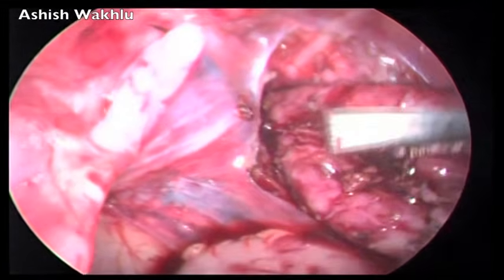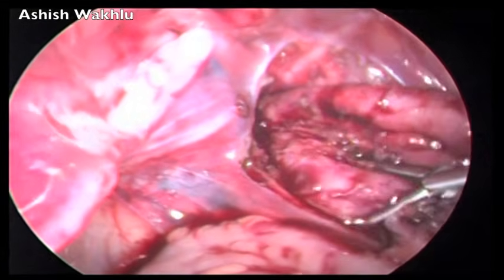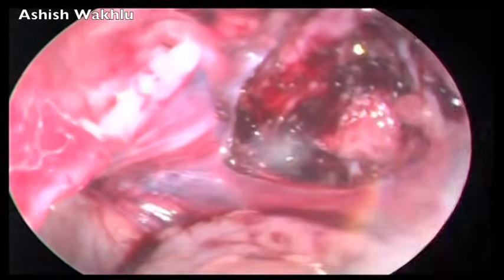So once the bleeding is controlled and the blood washed away, we get back to our dissection.